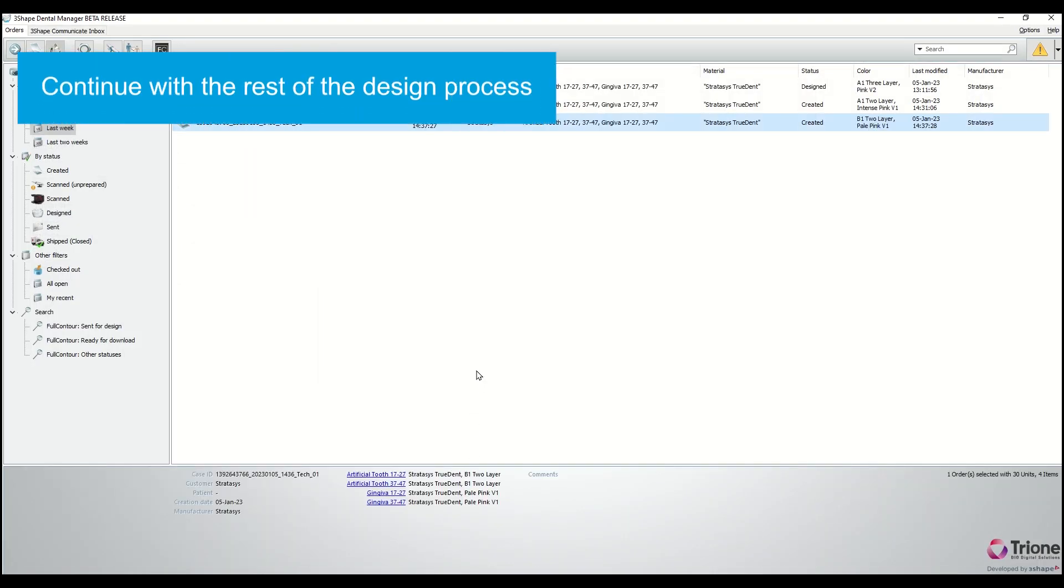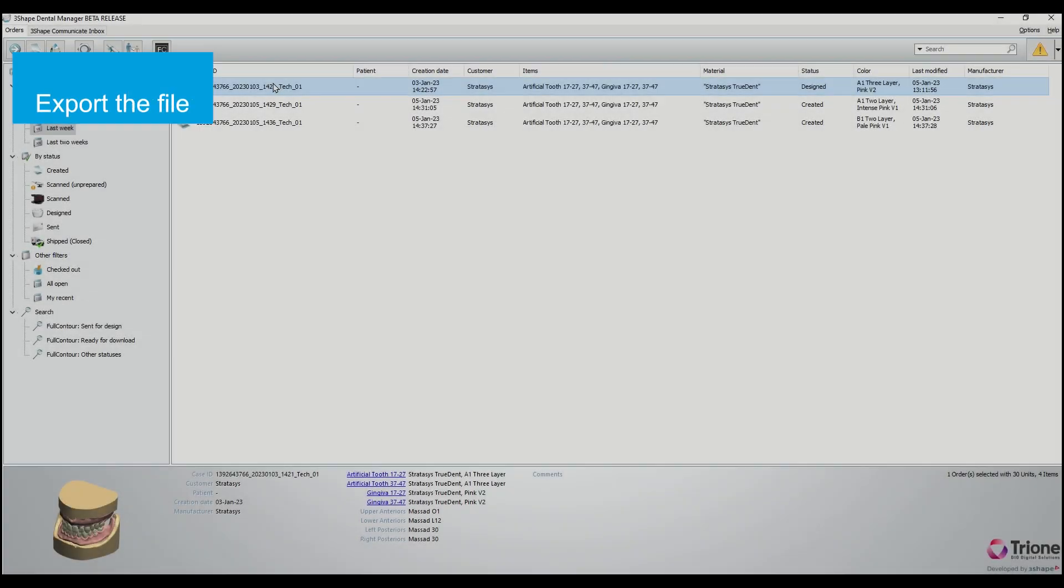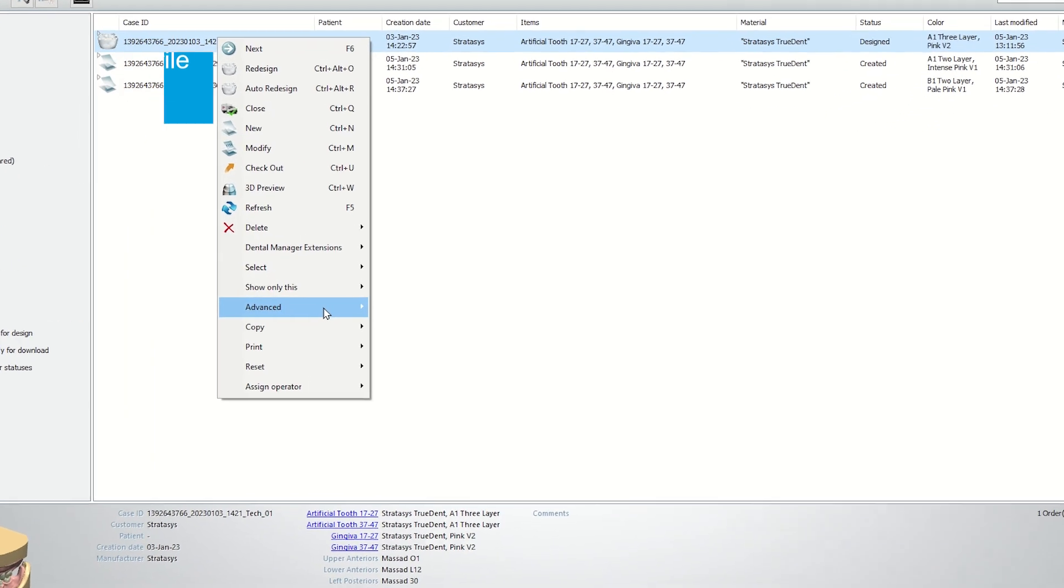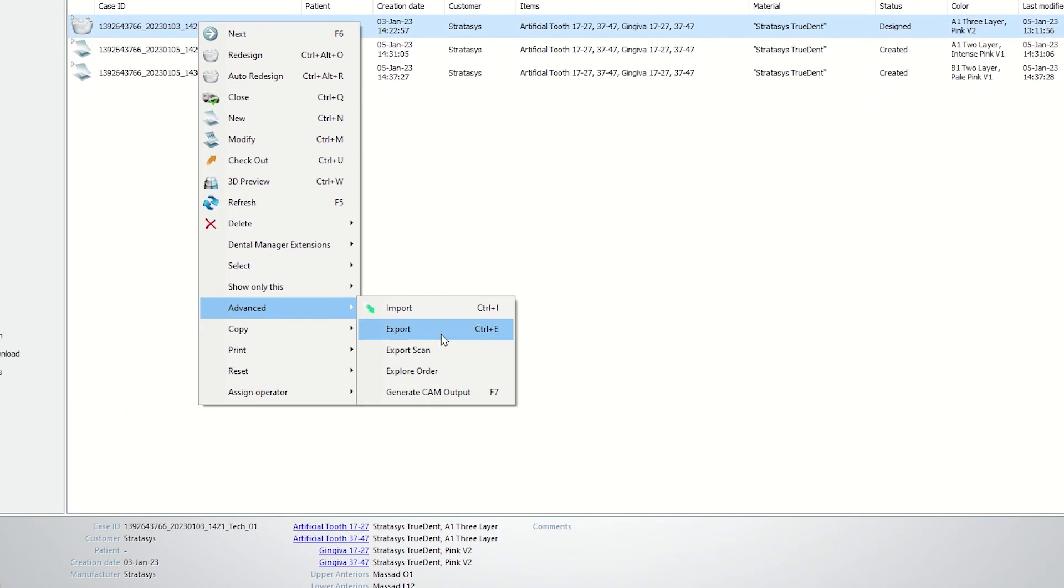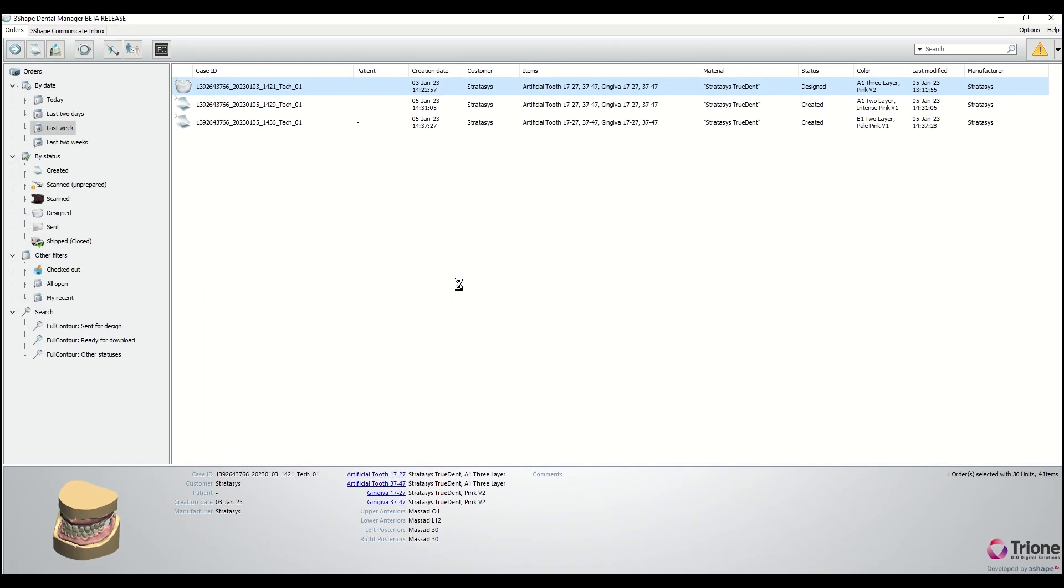Continue with loading the patient scan and the rest of the design process. When you're done, right-click the case, select advanced, and generate CAM output.